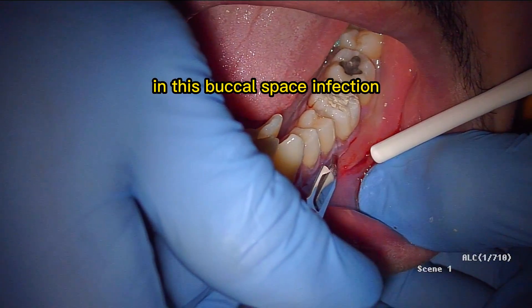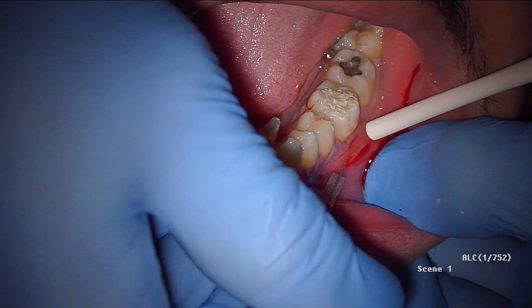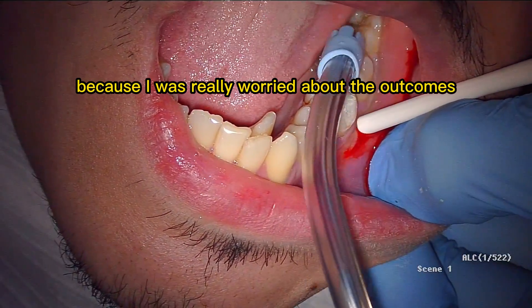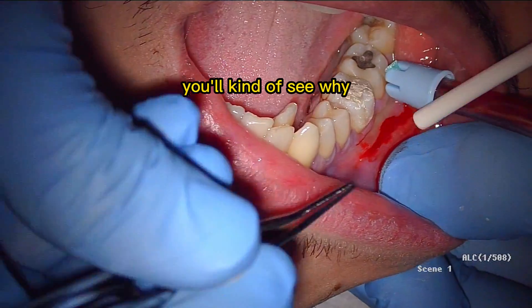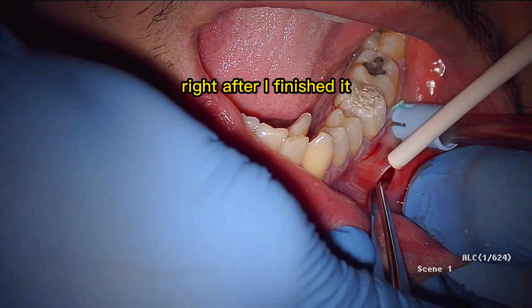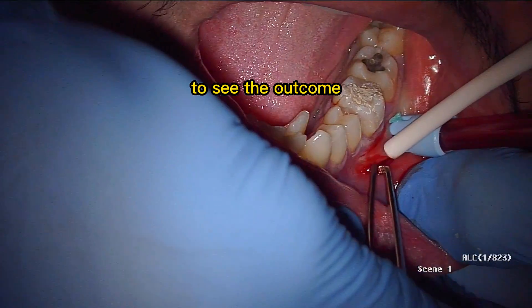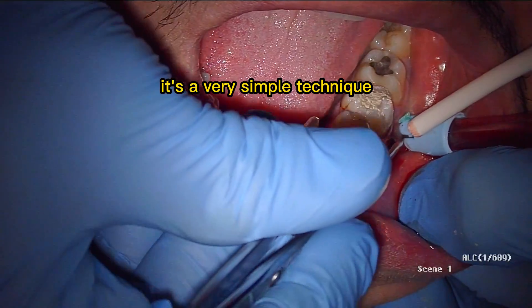We're going to do an incision and drainage on this buccal space infection — look at that flow. I've waited a few years to post this case because I was really worried about the outcomes. If you stick around to the end of this short video, you'll see why. I was very reluctant to post it right after I finished because I wanted to give it some time to see the outcome. We're doing an incision and drainage — it's a very simple technique.